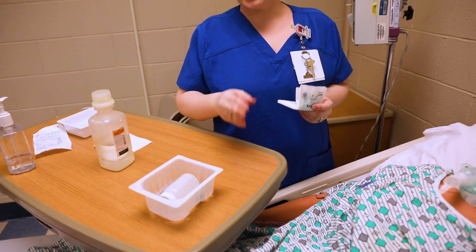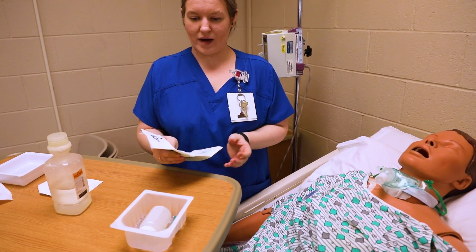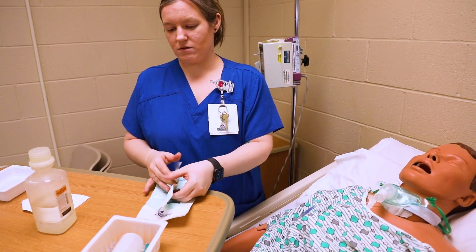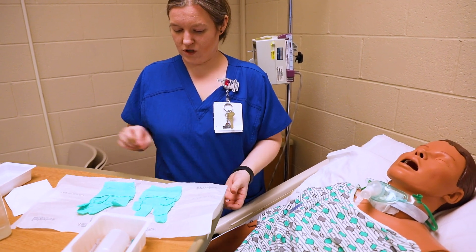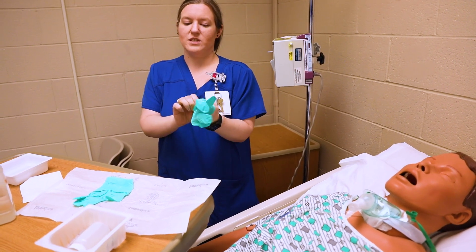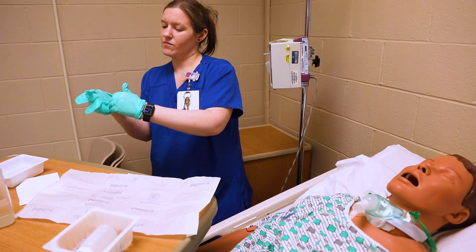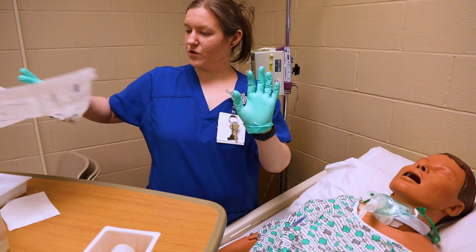Inside is my sterile gloves. I know these ones should fit me just fine, so I'm going to go ahead and use these ones. Right now we're hyperoxygenating our patient. I'm going to go ahead and slide them on. Make sure you check out that video on sterile gloving if you have any questions on how to do this procedure properly.